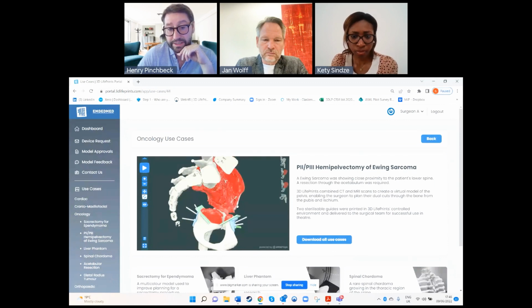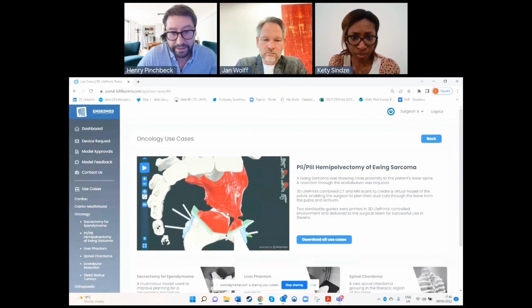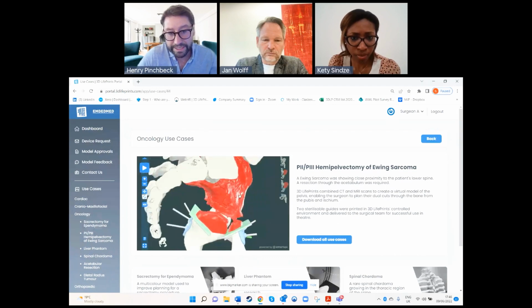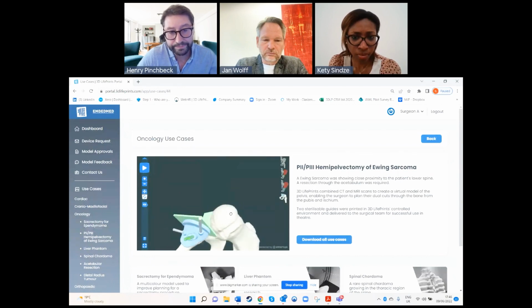This is actually relatively simplistic, honestly. There's only 2 guides here, and we would then determine these cuts here. It would be more complicated, for example, if you wanted a guide here as well on the bottom and another guide here along the top. But in this case, this is all we wanted. And we then design these cutting guides, which are the blue things here. You can see them picked out there.